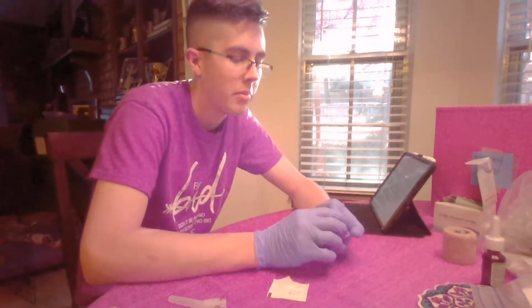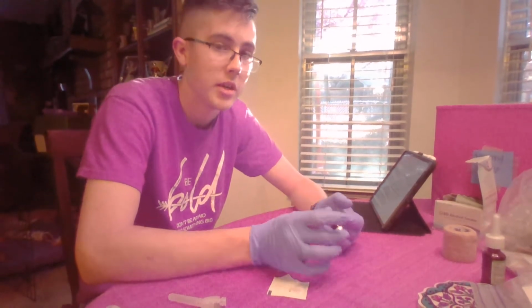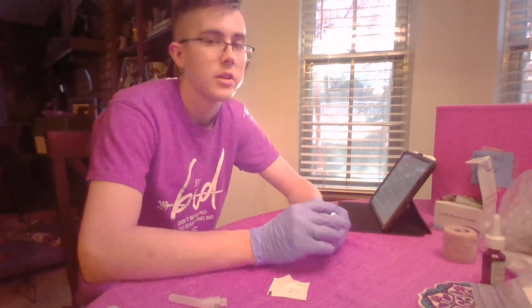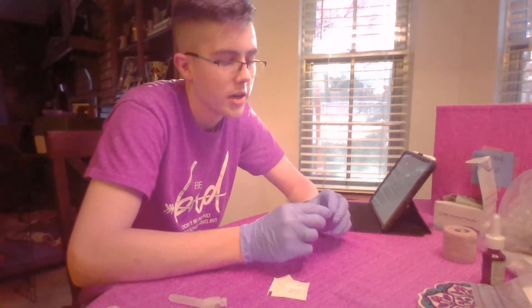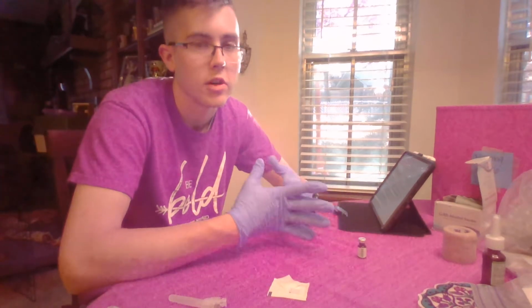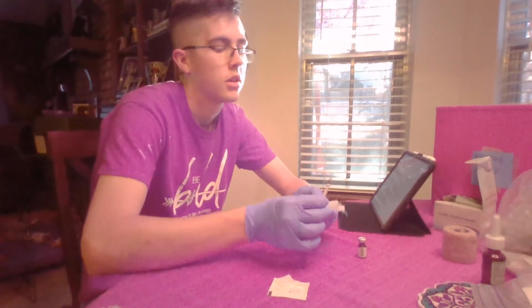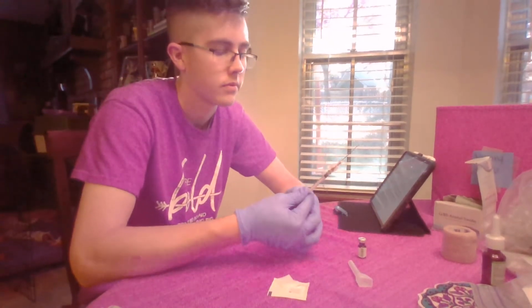After I've done that, I will find my medication, make sure it's the correct medication, I have the correct dosage, I'm going to be giving it at the right time, as well as I can give it the right route, so intranasally. I'll inspect my medication, make sure it's not expired, make sure that it has clarity, and then I will also check with my patient for 2 patient identifiers. Next, I will assemble my needle as sterilely as I can.